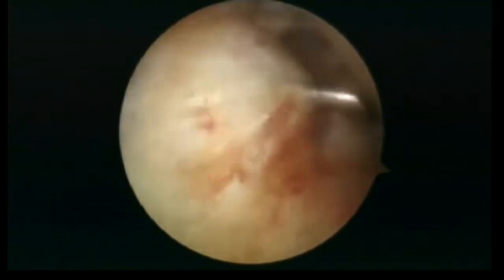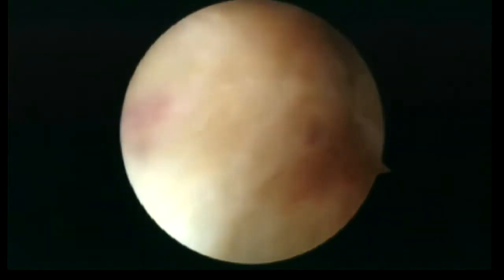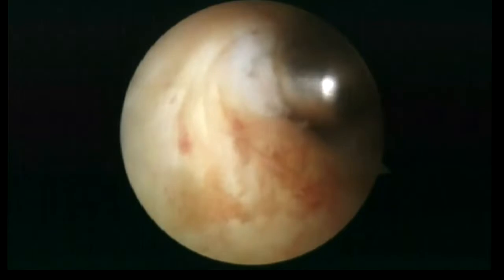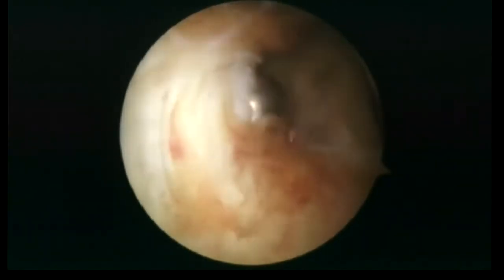Now, looking through the transseptal portal, the posterolateral portal is made. The radiofrequency probe is then used to perform partial lateral capsulotomy.